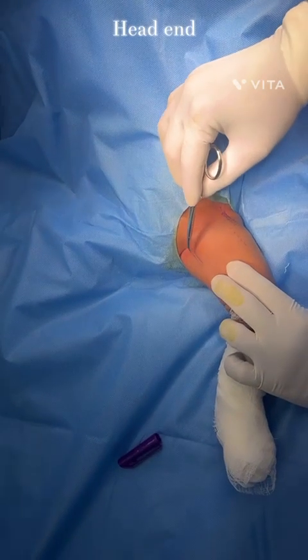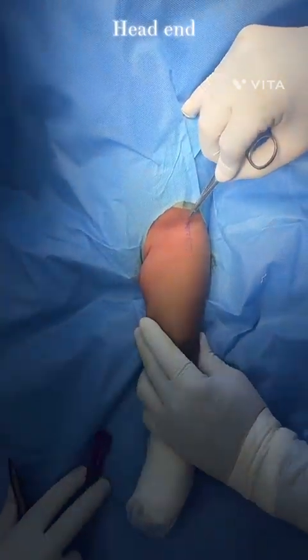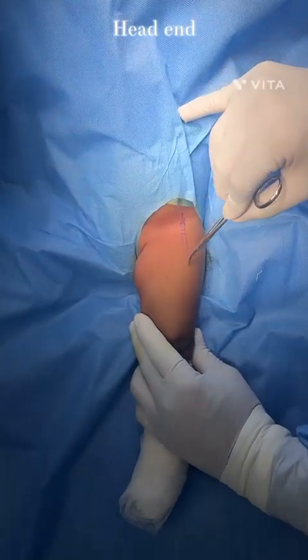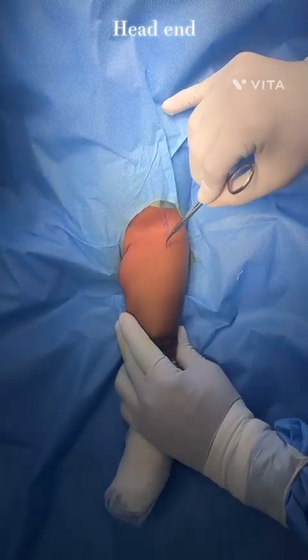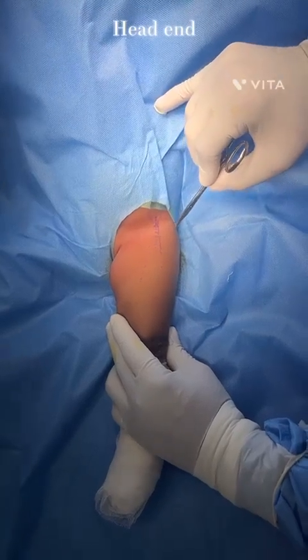This is the adductor tendon which we have marked, and this shows the ASIS. And from ASIS going medial is the sartorius, and this line is the tensor fascia lata. We take the incision in line along the ASIS between sartorius and tensor fascia lata.